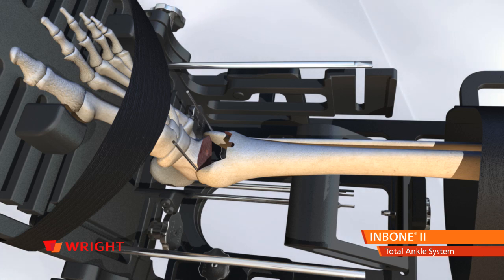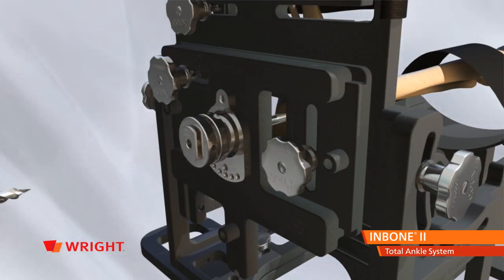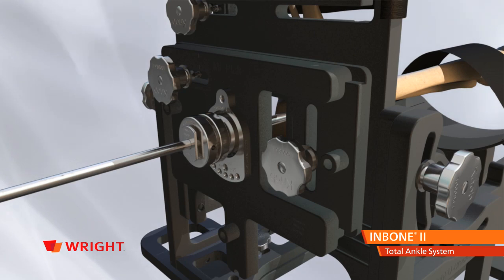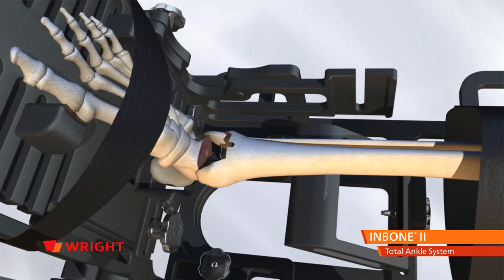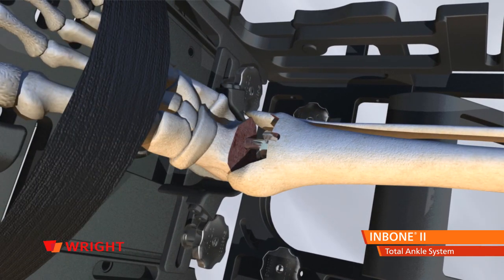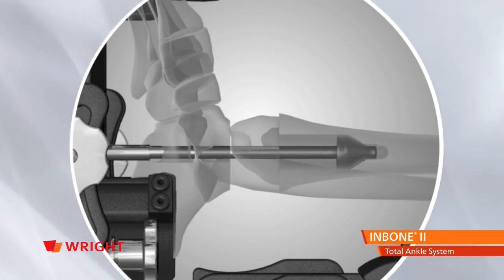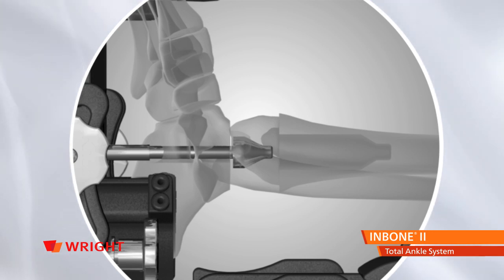Remove the Steinman pins and the rest of the tibial section. Remove loose bone pieces and irrigate the joint space. Remove the 6 millimeter drill and replace it with the drive rod. In the visible joint space, connect the reamer tip to the drive rod using the appropriate size clip and reamer tip. Ream to the desired depth based on the number of stem pieces previously templated. While turning clockwise, retract the reamer into the visible joint space.